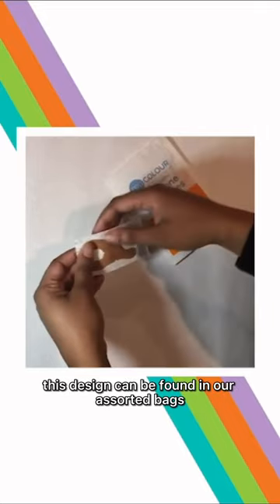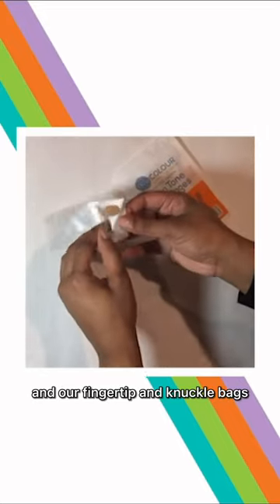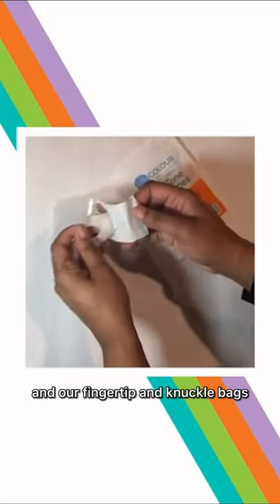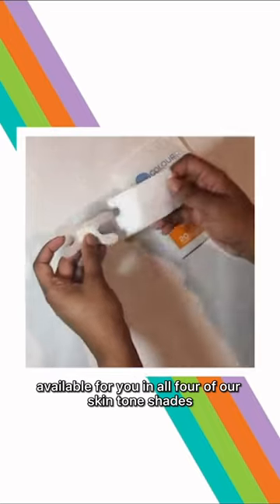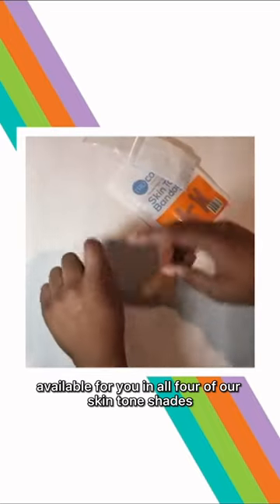This design can be found in our assorted bags and our fingertip and knuckle bags. Available for you in all four of our skin tone shades.